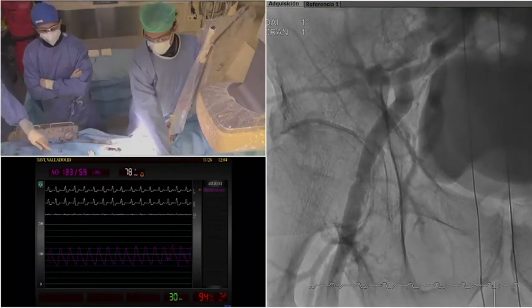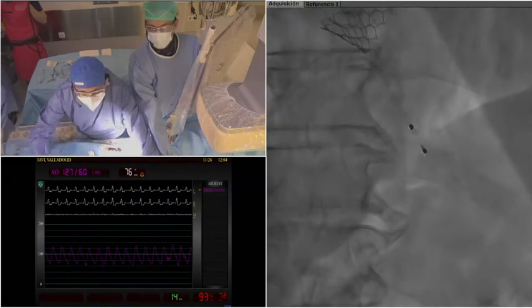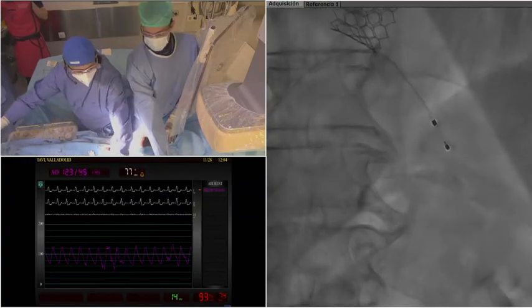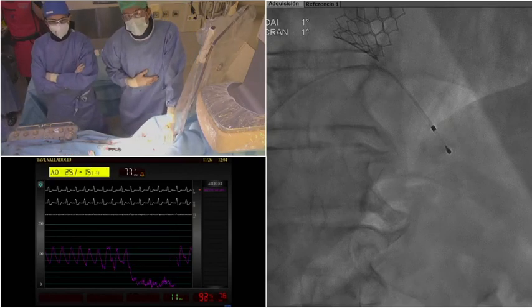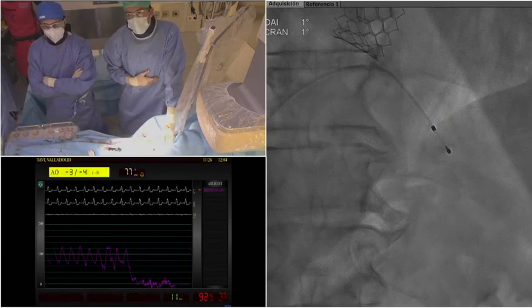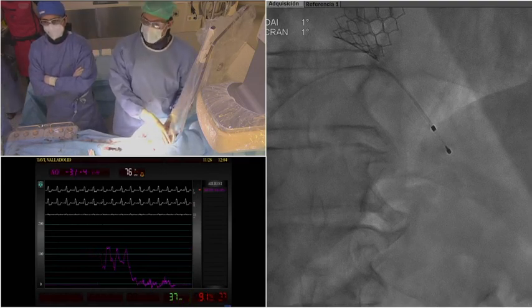Great, Ines. So it was a beautiful demonstration. Just before leaving you, would you try to enumerate the potential advantages of the Myval in comparison to the Sapien, concerning the size, the crimping and so on? What do you think?